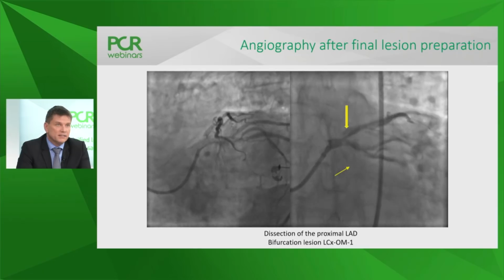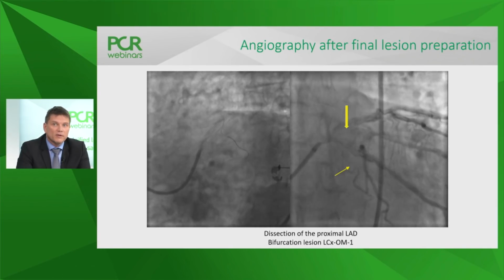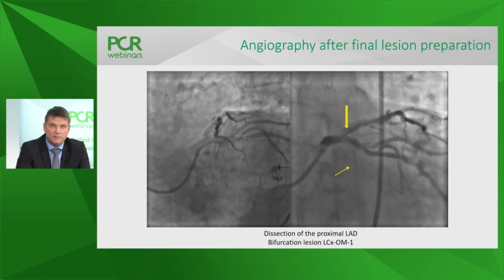And if we now want to discuss stenting strategy, in this way we will also address one of the comments of the colleagues. What would be your main vessel to target? I mean, would you stent left main circumflex, left main LAD? What is your preferred strategy here? Well, the main vessel for me, this is a huge circumflex by the way, but the main vessel is still also the LAD. So it's always difficult to tell in a left main.